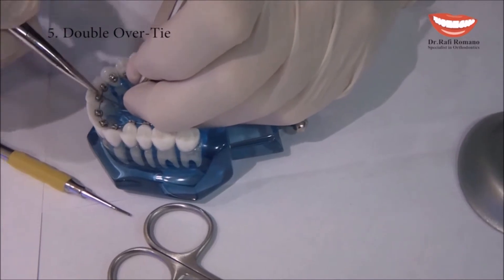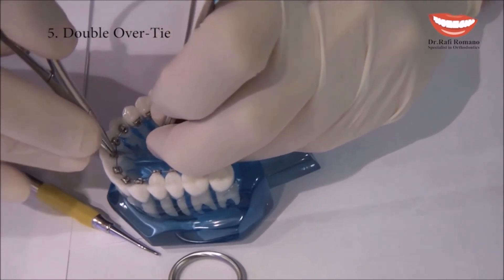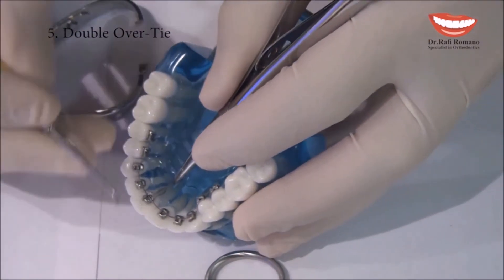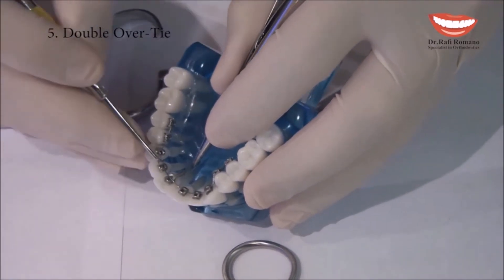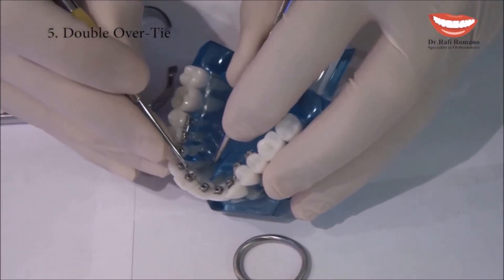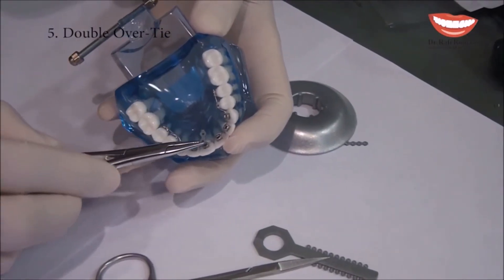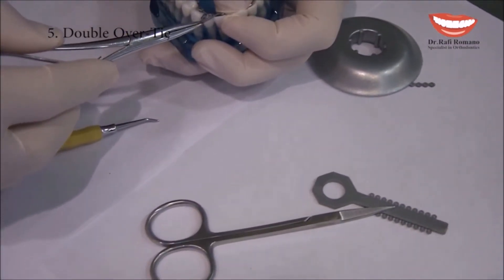Then I put the power chain over the bracket as if it were an elastic module. Now we secure the wire in the slot with a ligature director, then we pull the elastic chain and place it above the wire.